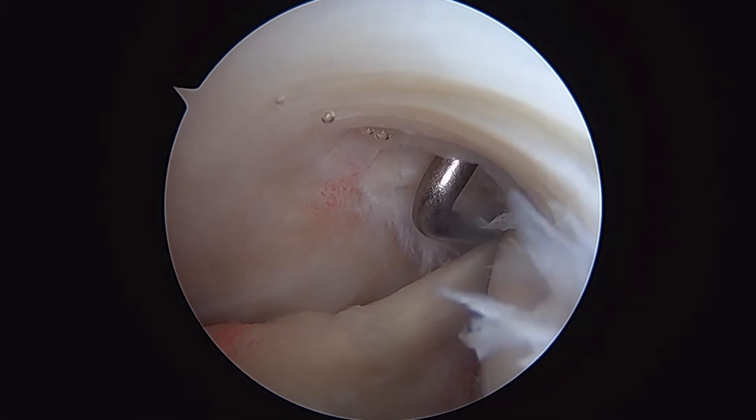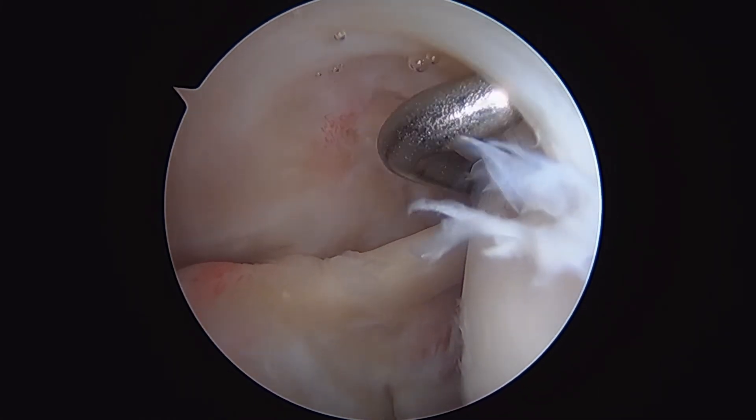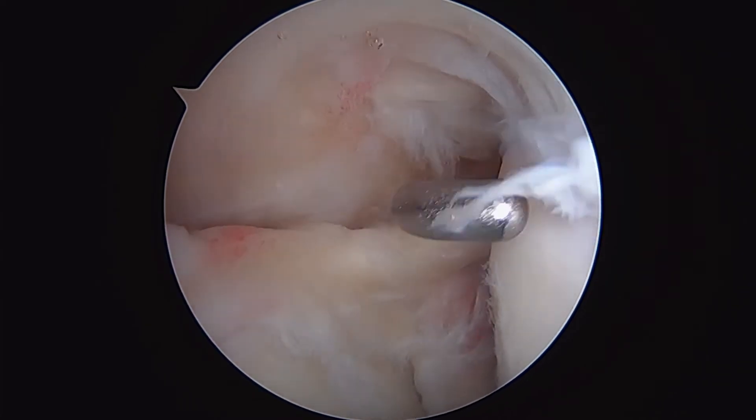If we look up, here you can see an intact rotator cuff, coming across the top of the glenohumeral joint and attaching to the humeral head.